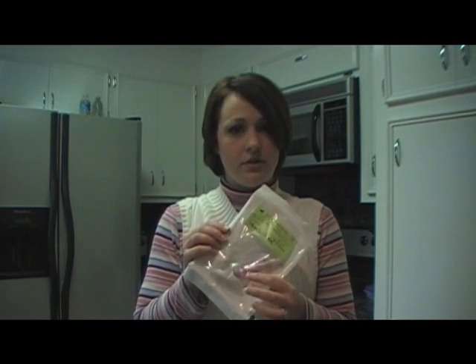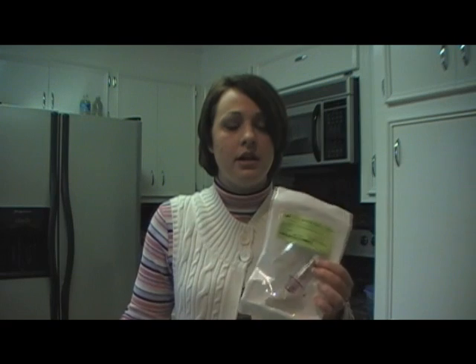When Dexcom sends their sensors to you, it comes in a box of four, because one per week you'd use four in a month. Sometimes you can order them every three months and get three boxes. My insurance won't let me get but one box at a time, so one box a month.